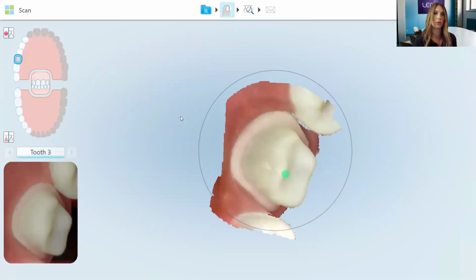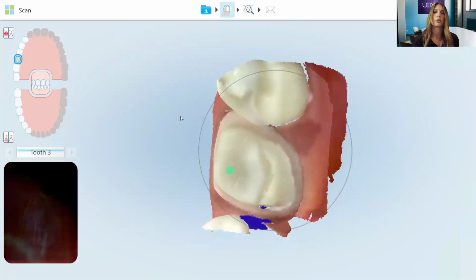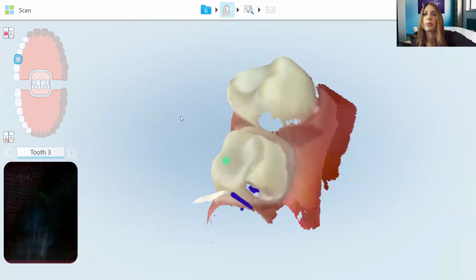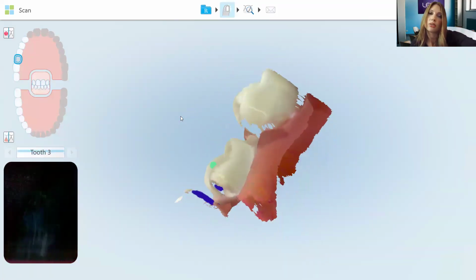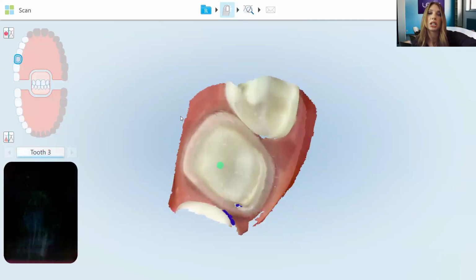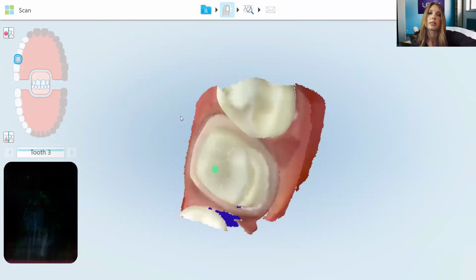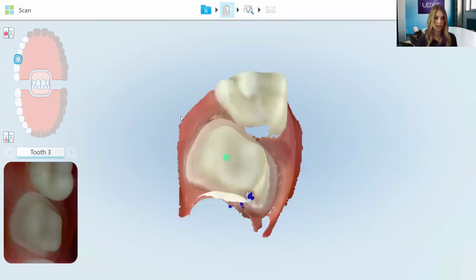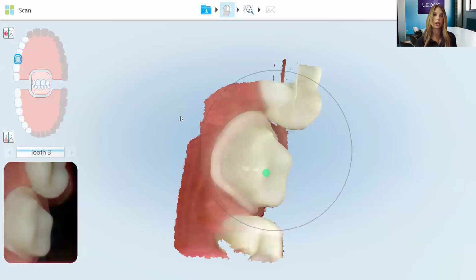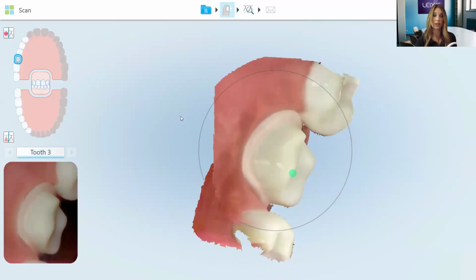Again, I'm gonna roll lingual, and I'm gonna just show you. So see, I'm gonna leave my scanner on. I'm gonna turn this around. See how my buccal surface, I actually got a lot of data. My lingual got a lot of data, but it kind of looks a little fuzzy. So when I go back in and I roll directly lingual, see how much clearer that is?